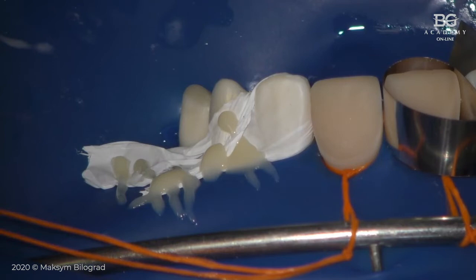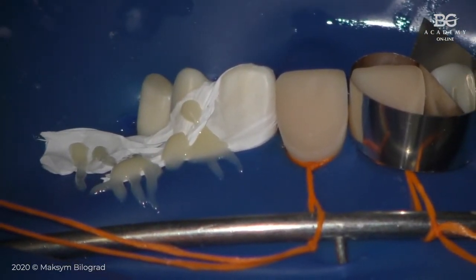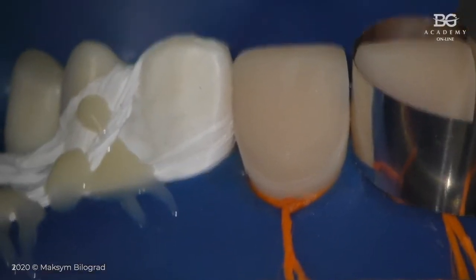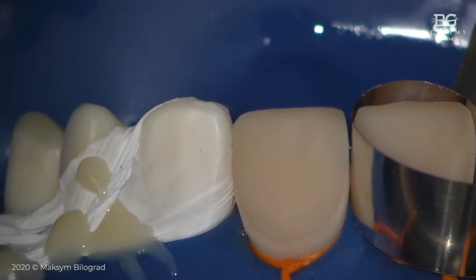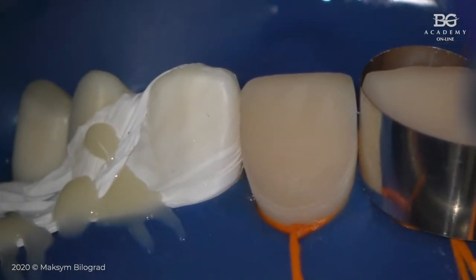We're ready for another step. Now we will do etching, okay? So the first scenario, we have all enamel. And it doesn't matter what type of adhesive system you will use. I mean, total etch adhesive system or self-etch adhesive system, you still have to etch enamel.